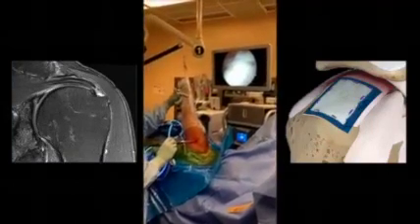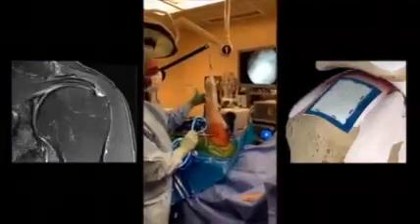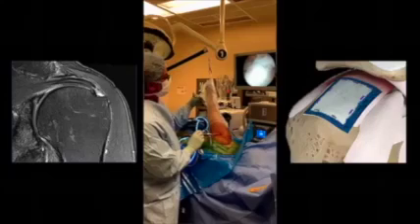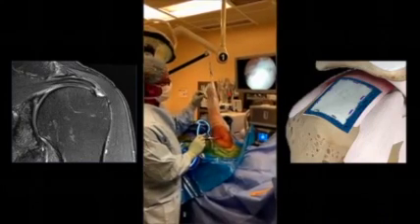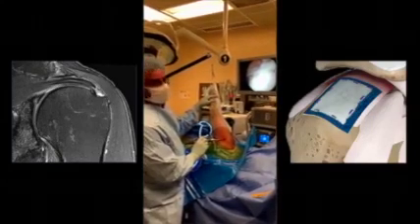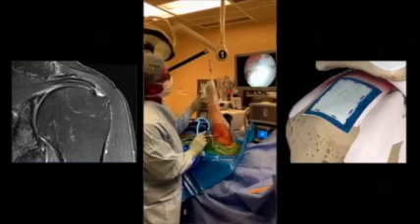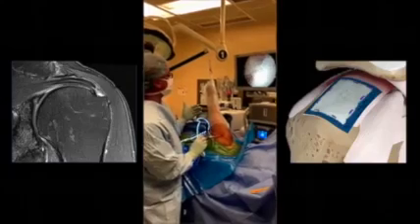So Regeneten patch, bovine bioinductive implant. It's a super cool new way to really dramatically improve your pain and function. In addition, we're using an Exparel scalene block on this patient, which is also amazing. She's going to get 5 days worth of analgesic pain relief associated with the block. This woman will not take a single post-operative narcotic pill. She'll have near full range of motion in 2 to 3 weeks. She's out of a sling in 2 to 3 days and probably will not require physical therapy. This is a remarkable transition compared to what we were doing previously.